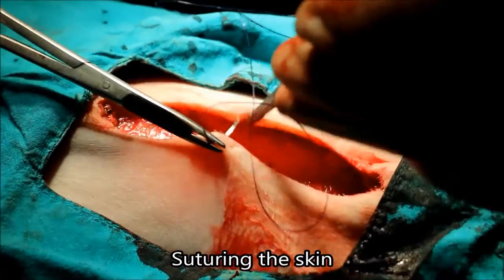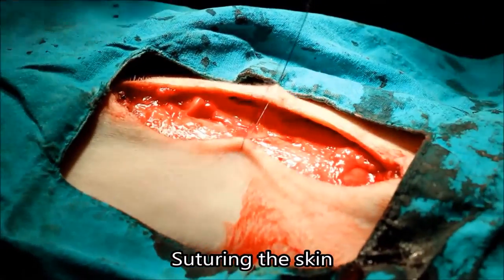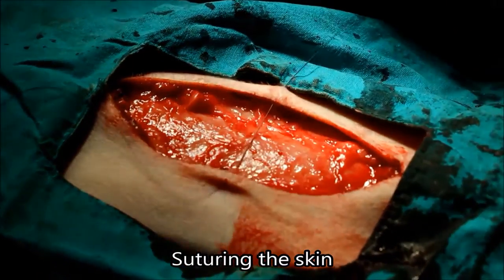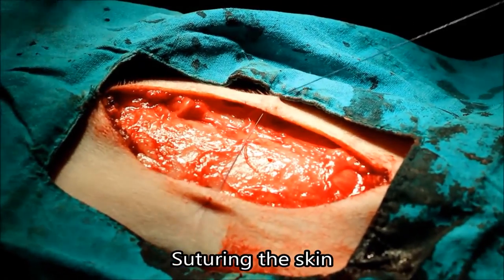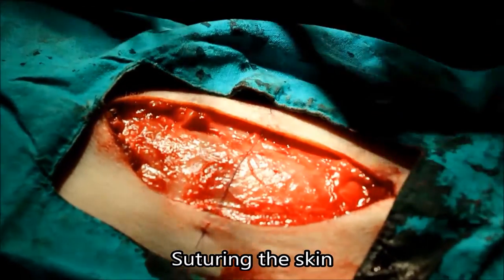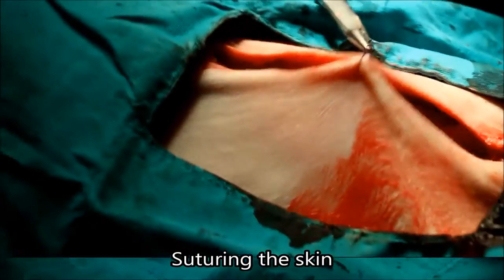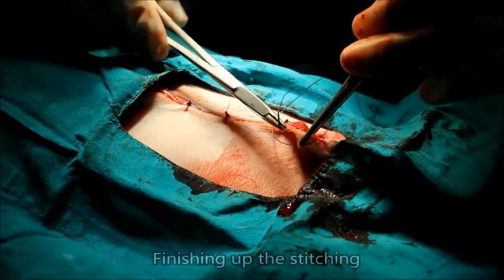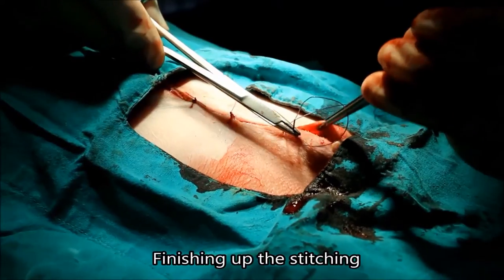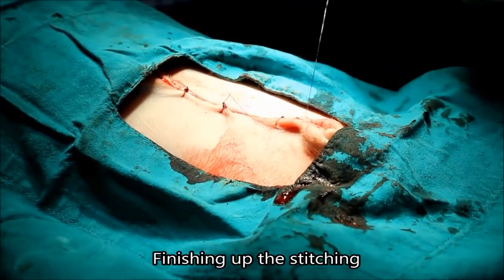The vet uses 3-0 absorbable monosin sutures to stitch up the wound. Here he is finishing the stitching of the wound.